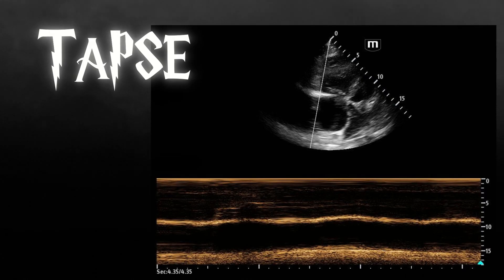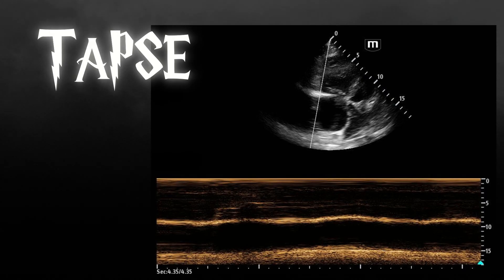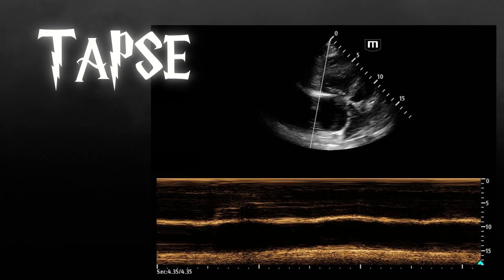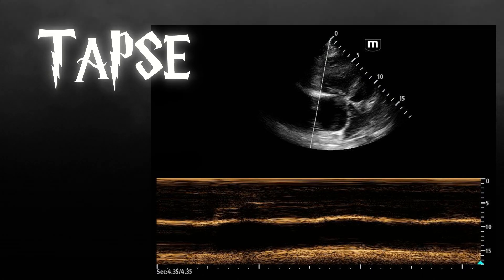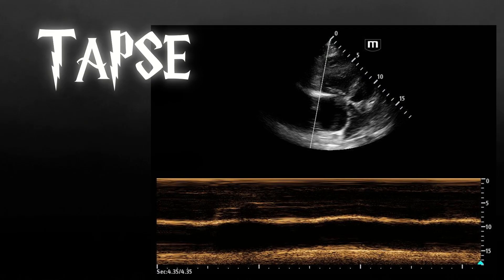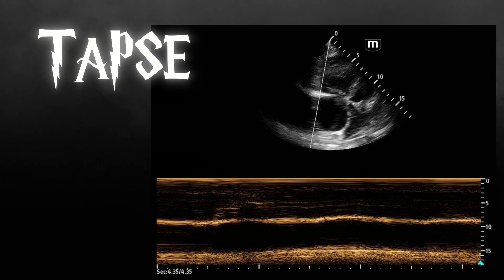The RV systolic function is measured by something we refer to as TAPSE — tricuspid annular plane systolic excursion. It's the concept of how well the tricuspid annulus rises during systole and relaxes during diastole. We measure it with M-mode through the lateral wall of the tricuspid annulus.